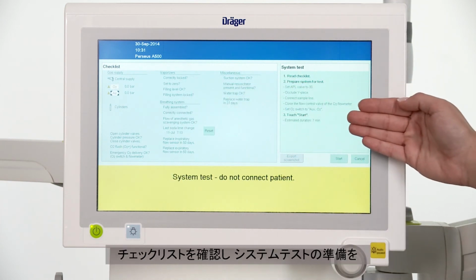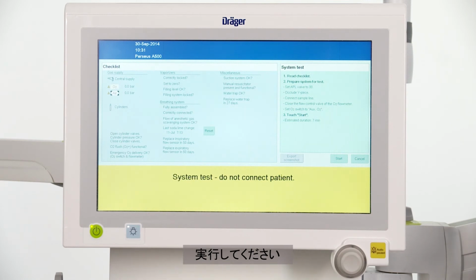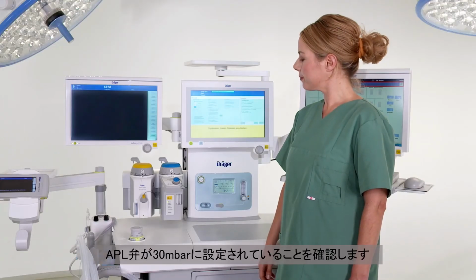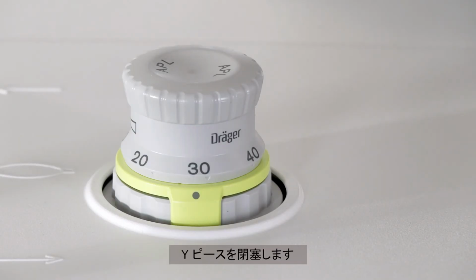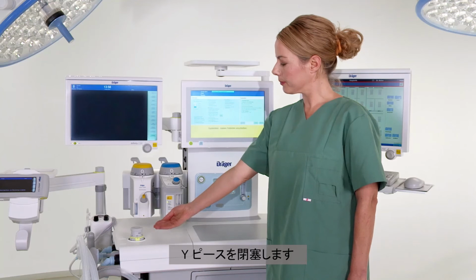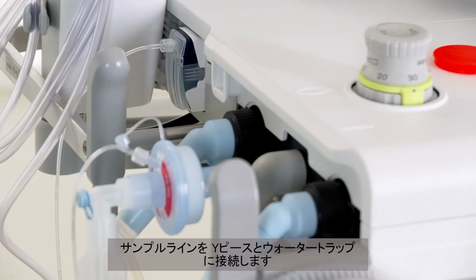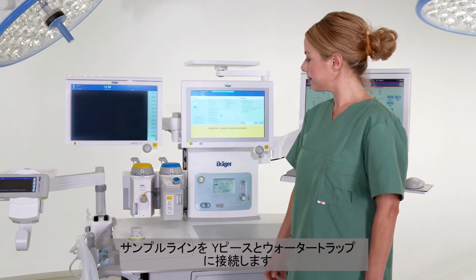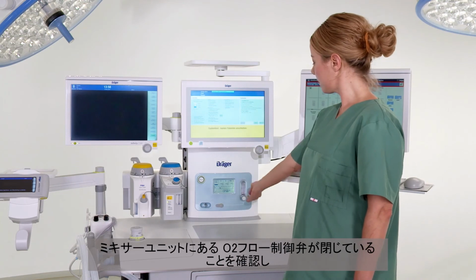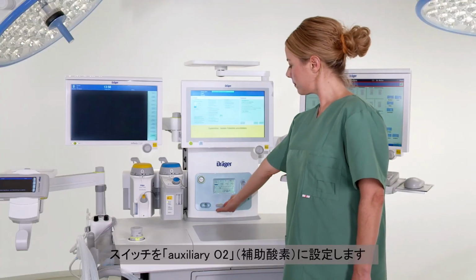Go through the checklist and perform the preliminary steps for the system test. Ensure that the APL valve is set at 30 millibar. Occlude the Y-piece. Connect the sample line to the Y-piece and water trap. Make sure to close the O2 flow control valve in the mixer unit and set the switch to auxiliary O2.